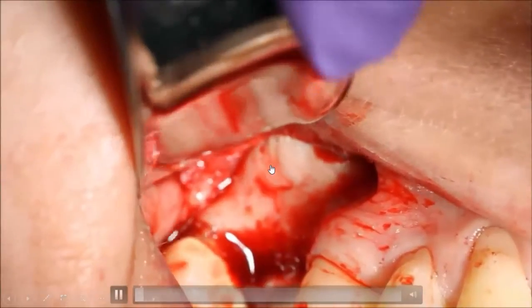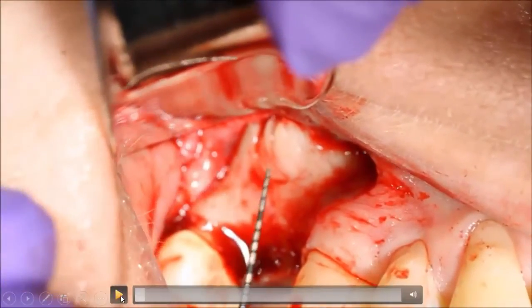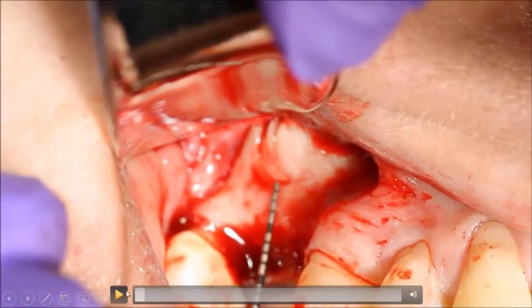Here we can see the window outline, and we have the inferior border. As we can see, the inferior border should be at least 5 millimeters superior from the alveolar crest. It should also be at least 3 millimeters from the sinus floor so we can use the curette and elevate the membrane, because if we put the inferior border on the sinus floor, we will end up with perforation and we will not get a sinus lift.